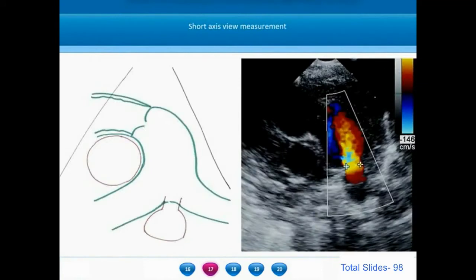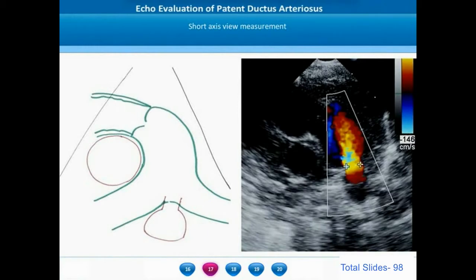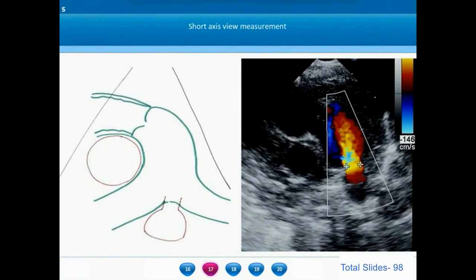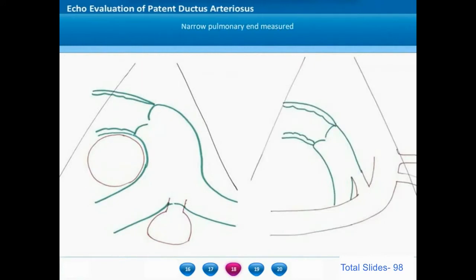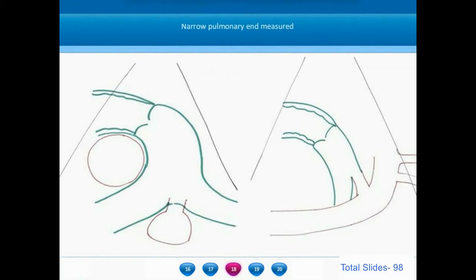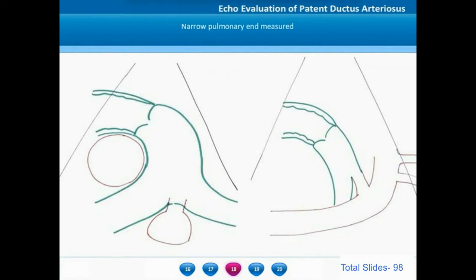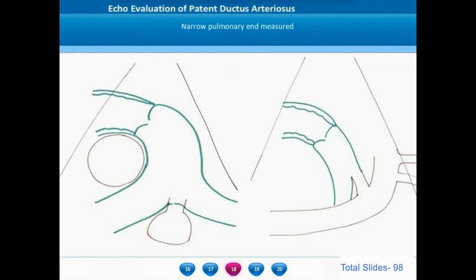On the short axis view, the ductus is again measured. This measurement gives the width of the ductus — from the right end to the left end. The previous measurement on the sagittal plane refers to the dimension from the superior to inferior end. So the narrow pulmonary end of the ductus is measured in two different views: in the short axis for right-to-left dimension, and in the long axis ductal view for the upper-to-lower dimension.